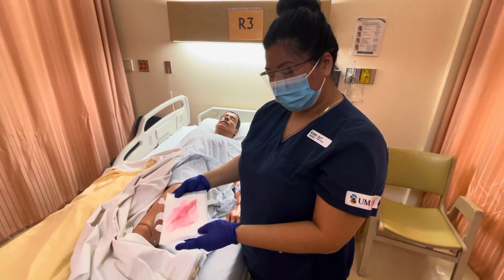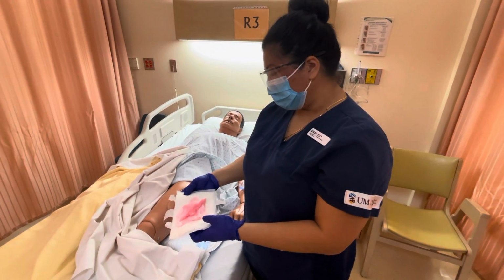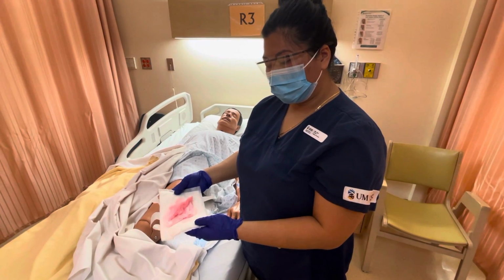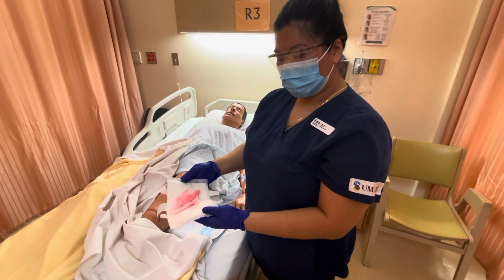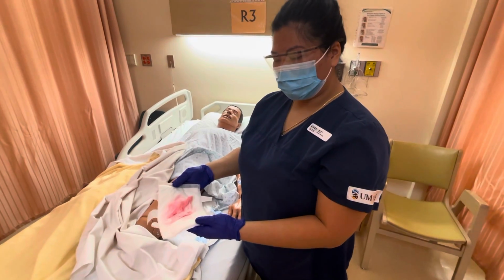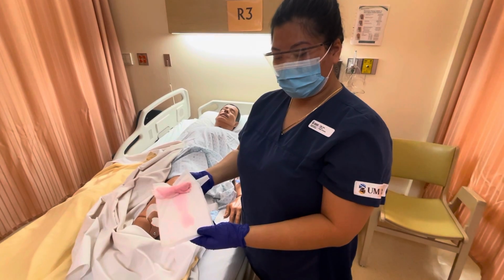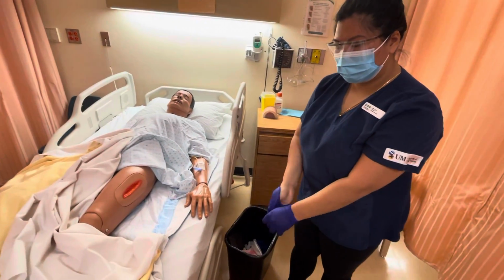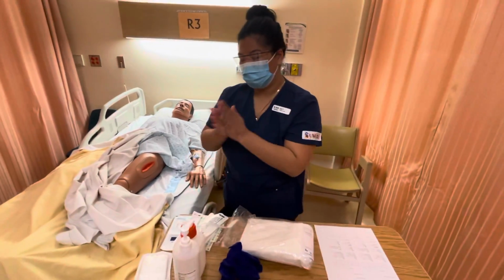So there's no foul odor, it looks like it's saturated 100% of the wound packing, so that's 100% saturated 4x4, as well as another wound cover. There's two 4x4, so 100% saturated with serosanguinous exudate, and then it looks like it also shadowed through the abdominal pad, so about 20%. So we'll just throw this into our garbage and change our gloves right away, and then do another hand hygiene.